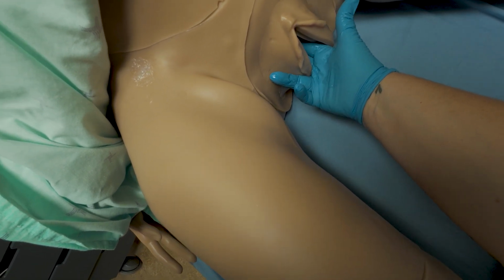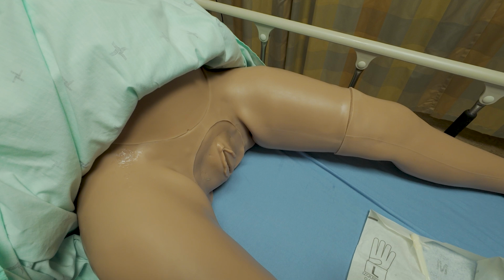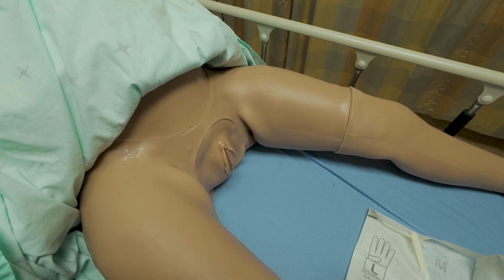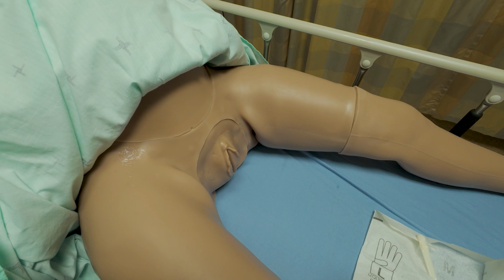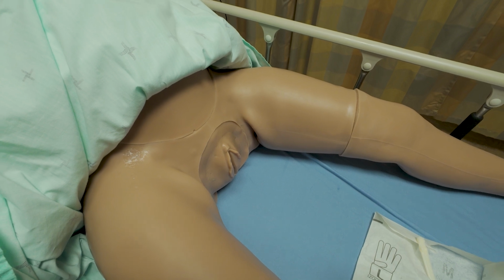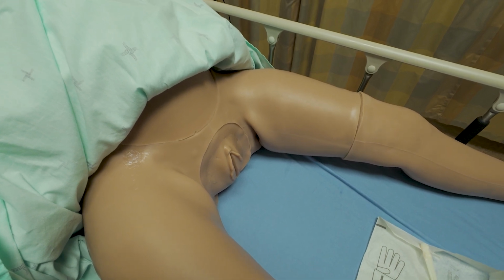We're going to take our hand out and monitor the fetal heart. We always want to make sure that the baby is happy after we perform an AROM. If you're in a hospital setting, you can apply the EFM. If you're in a home setting, you can listen for a minimum of 10 minutes post-rupture to ensure that the fetal heart rate is normal and that the baby is happy. In this case, the baby is experiencing some decelerations, so we're going to move right on to applying a fetal scalp electrode.